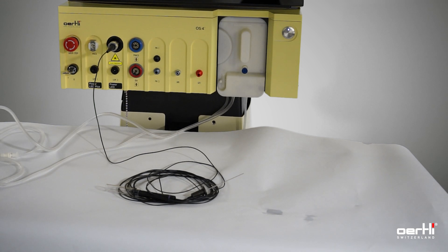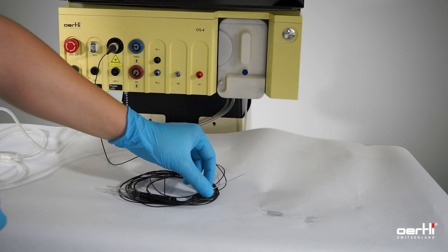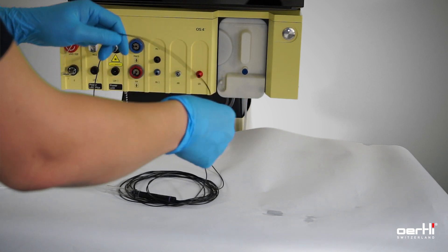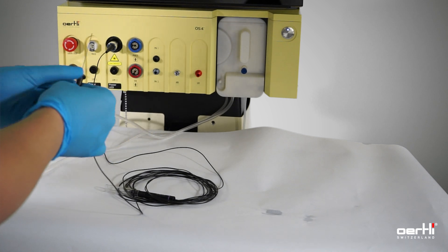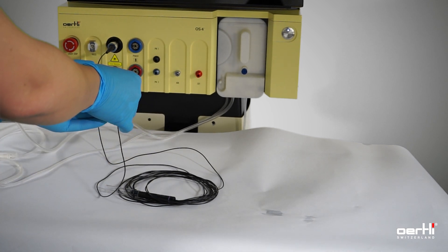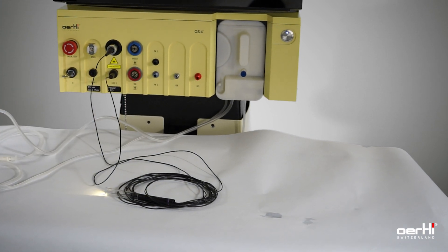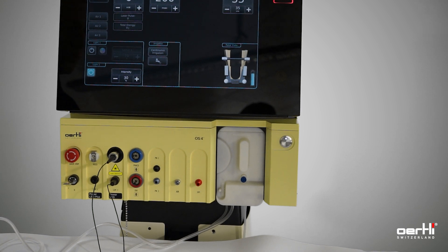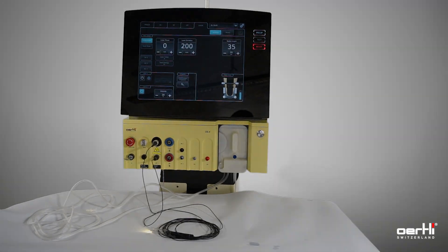With the illuminated laser hand probe, it's the same as without illumination, but you have an additional fiber with the already known LED magnetic connector. Use either LUM1 or LUM2 to connect the light, and ensure that the correct light source is switched on. Then follow the procedure for the non-illuminated laser hand probe and use the laser.